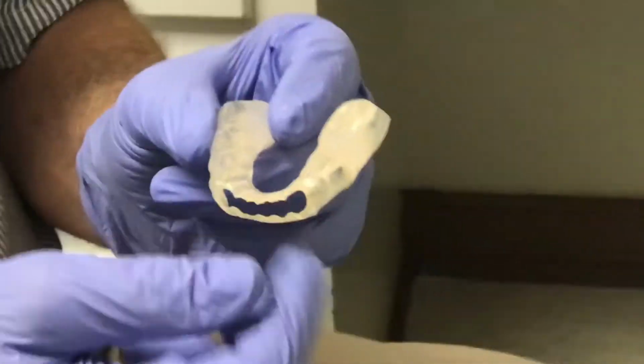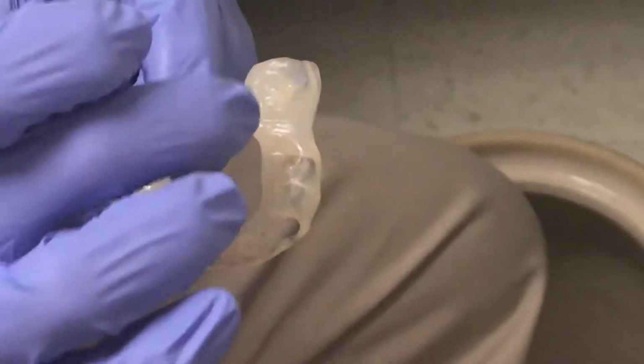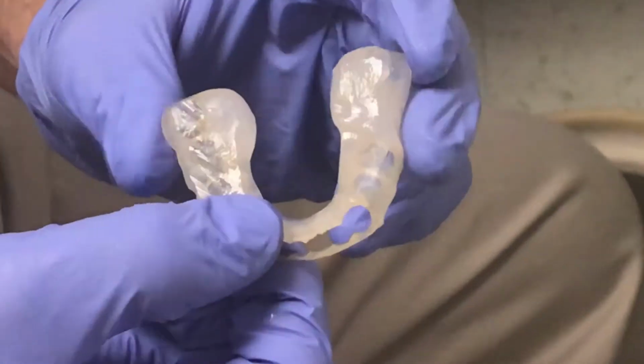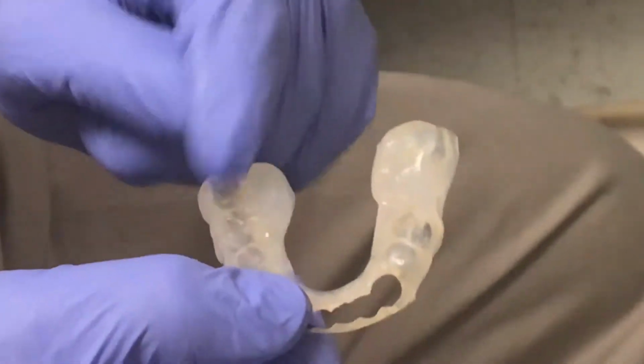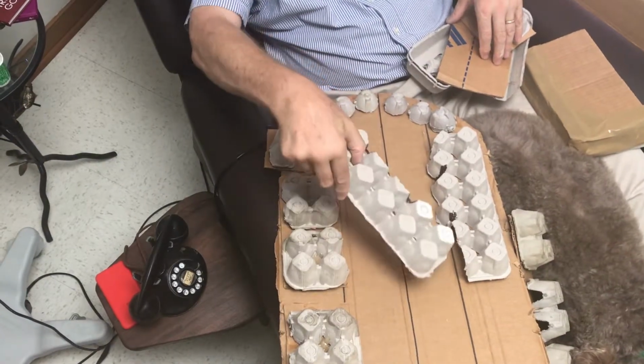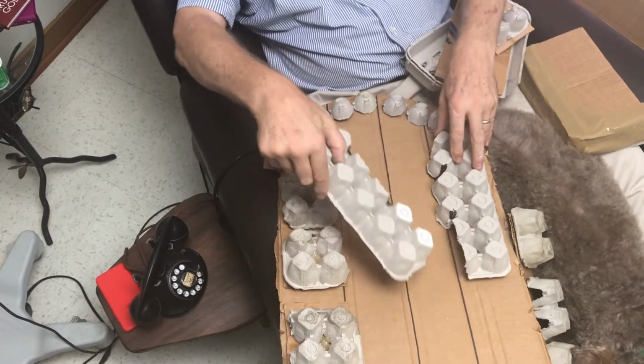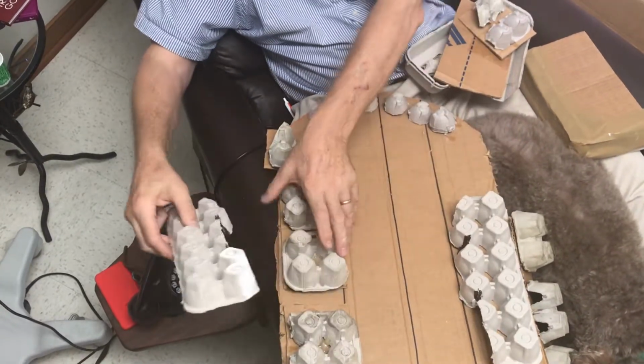This particular arrangement here would be as if we had a second molar here, and on the right side had taken some off of the contact so that the tongue can bounce off of this in the back.